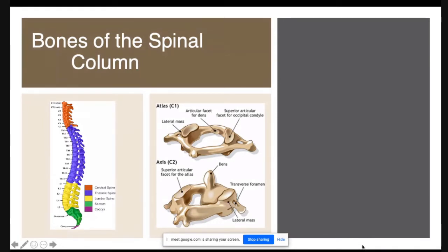So before going to the interpretation, let us see what the landmarks are which will often be repeated in the reports. We know that in the spine we have a few important names and a few important bony landmarks which give more idea related to the functioning of that particular part or the pathology related to that part. The questions will be asked, or the comments will be given, based on the anatomical landmarks.